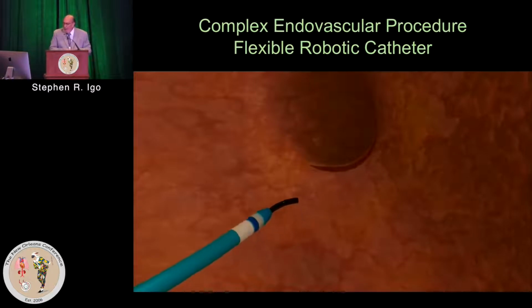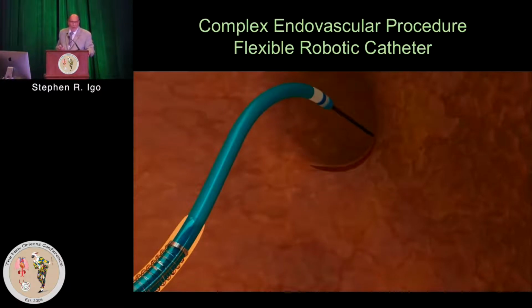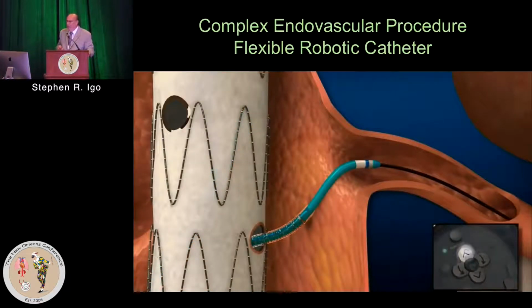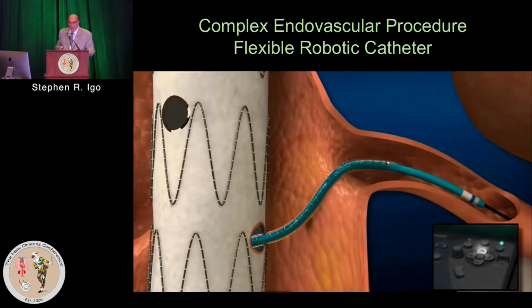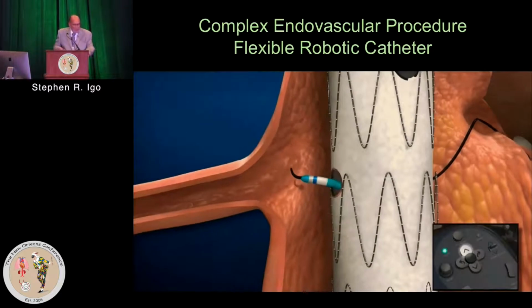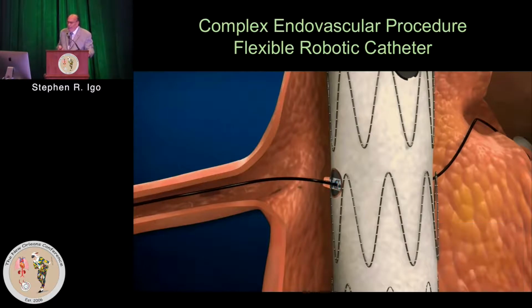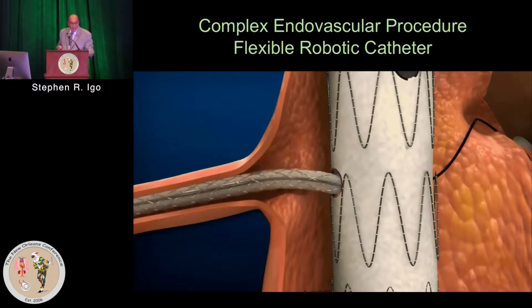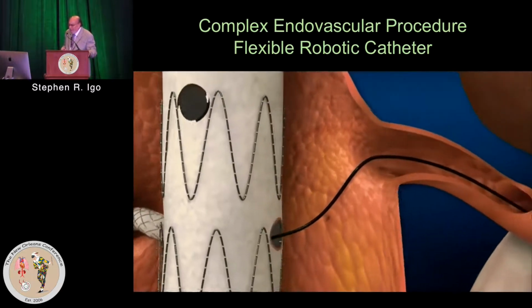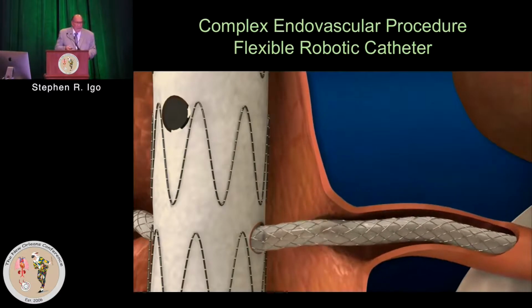Sometimes you're not in the right spot. You have to evaluate, hit that target, the renal artery, steer around, and that's why contrast agent, you're doing a lot of fluoro time sometimes to do this. All of these things kind of add up. Now, the question is, can we move this kind of a procedure to a completely autonomous catheter to complete these kind of complex endovascular procedures? Shorten the time, shorten the fluoro time, and reduce the radiation exposure. That's kind of the primary goals at the end of the day.